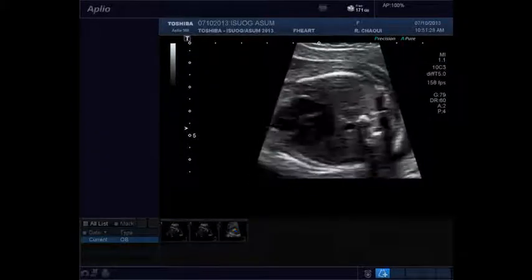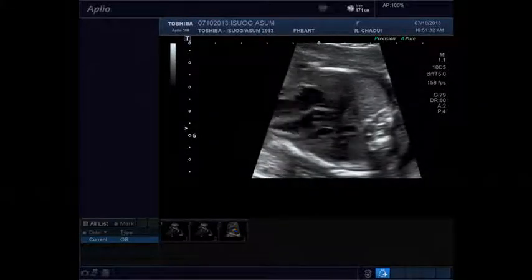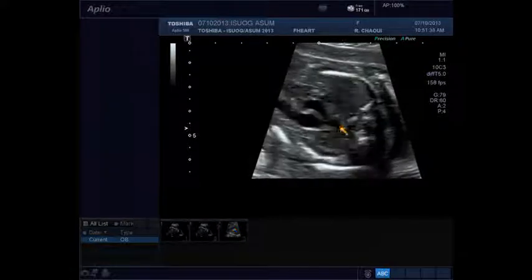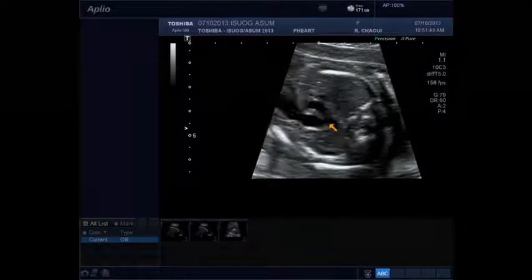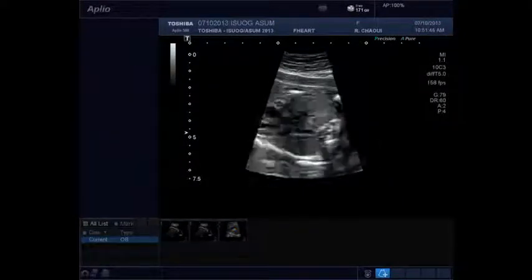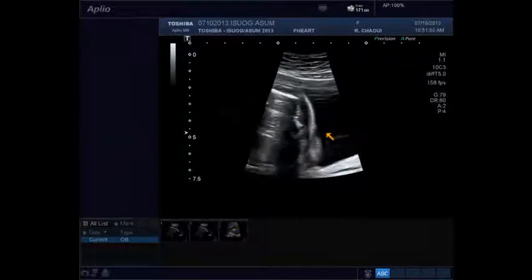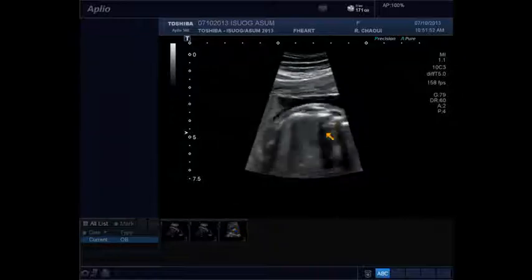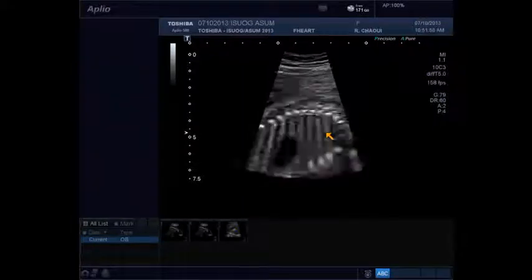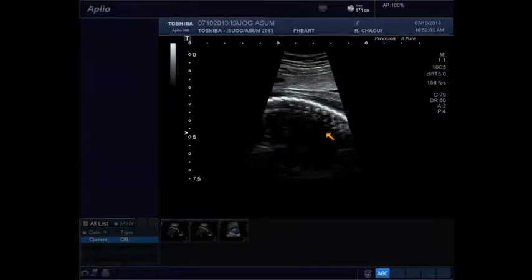Yeah. But let's say in this condition, I showed you how I take it abdominal, but let's say from apical, I will try to turn the baby because the other plane to get the aortic arch is from here. Make the picture smaller. I show you, the baby is now turning this way. But I try to turn the baby to get the other view. Not anymore. So, I agree with you. I don't think the long axis views are required for routine screening. I think most of the information you can just get from the three-vessel tracheal view.